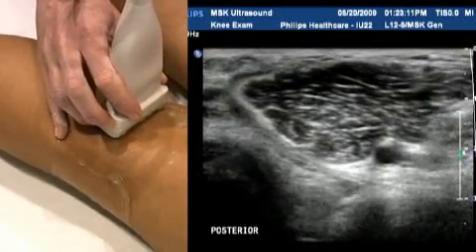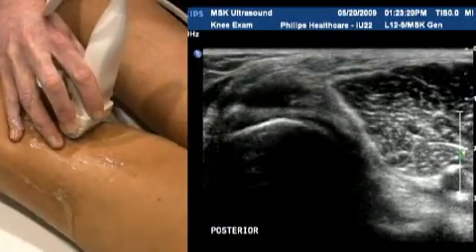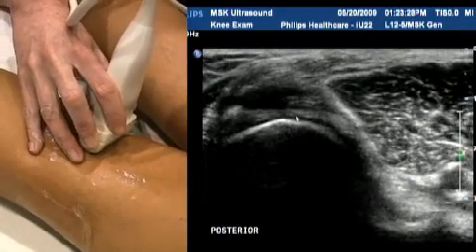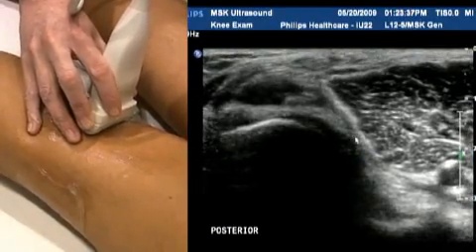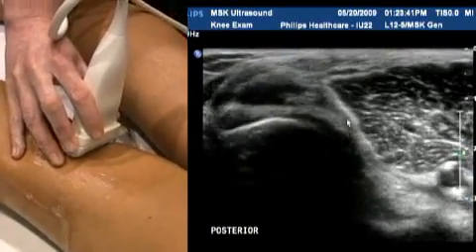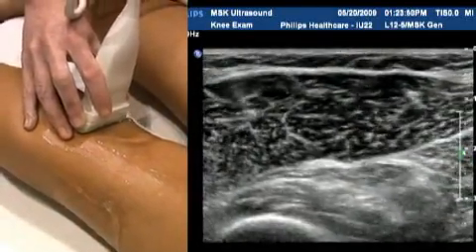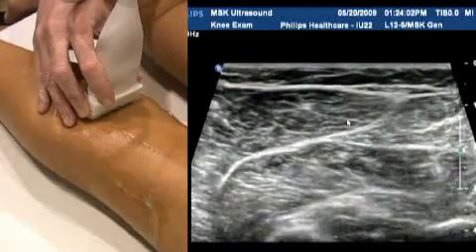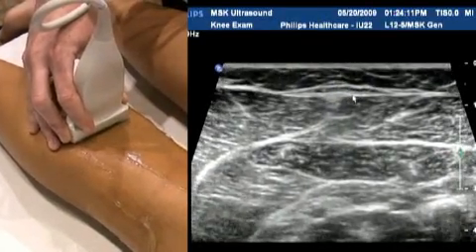A Baker's cyst is going to appear medially in the popliteal fossa, lying between the semimembranosus and the medial gastrocnemius muscles. Our patient here doesn't have a Baker's cyst, which is a good thing, but it would arise from that portion of the popliteal fossa surrounding the medial gastrocnemius distally. You can extend your study if the patient has pain extending down into the proximal calf — you can see this is where the short saphenous vein sits, and you can look for thrombosis there as well.